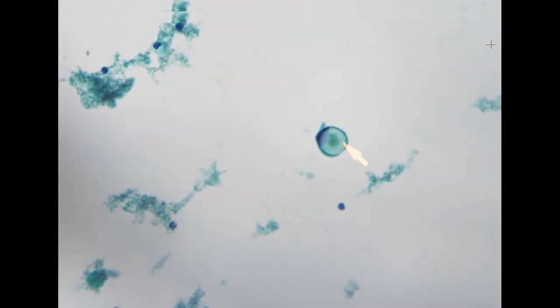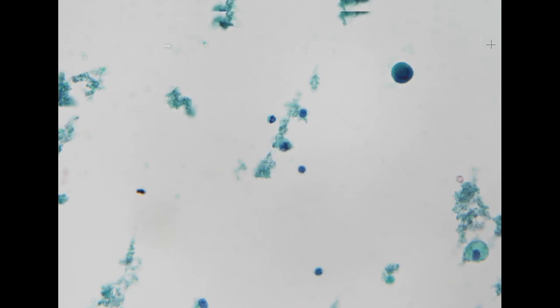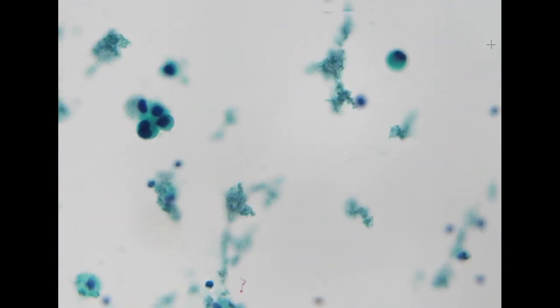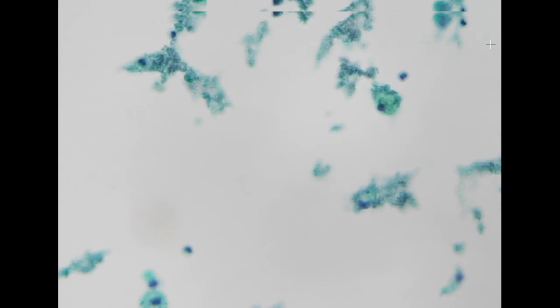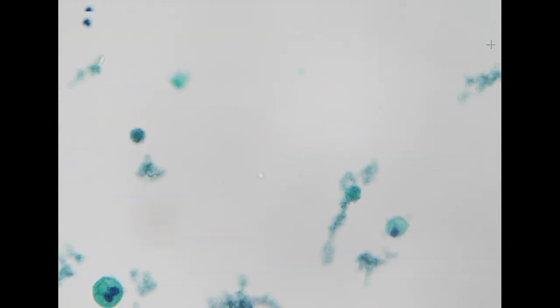Another signet-ring cell. So despite the patient's past history of prostatic cancer, the overall morphologic pattern is a little bit unusual for prostatic cancer. So I think these need to be checked by immunohistochemistry with the concurrent biopsy specimen. If this is the only specimen, I think this is compatible with prostate, but the background necrosis is a little bit too much, and we do identify occasional cells with signet-ring type of morphology, which is relatively unusual. So these need to be confirmed.